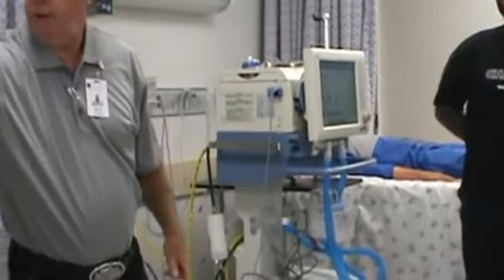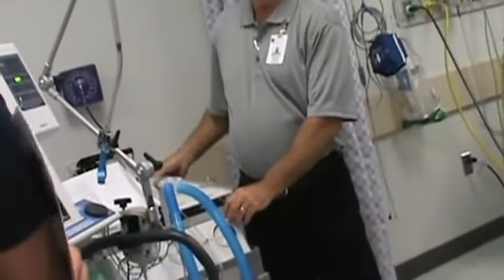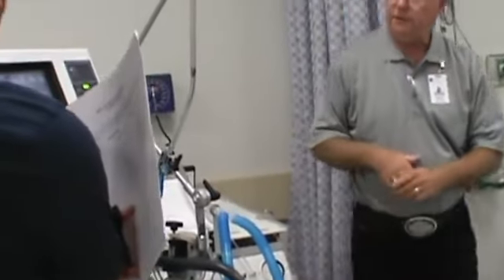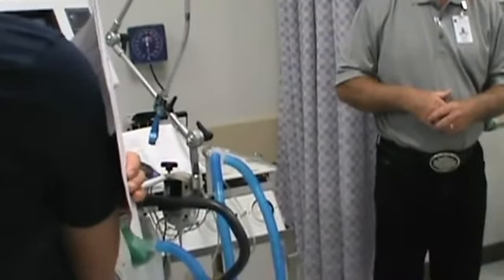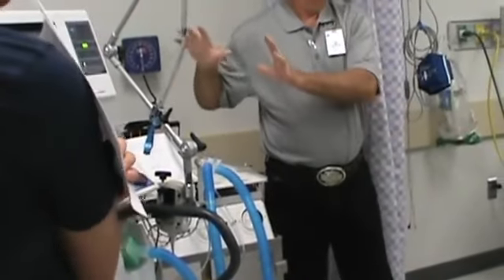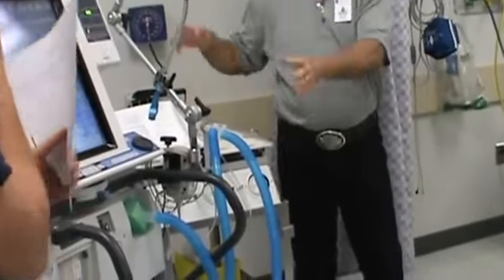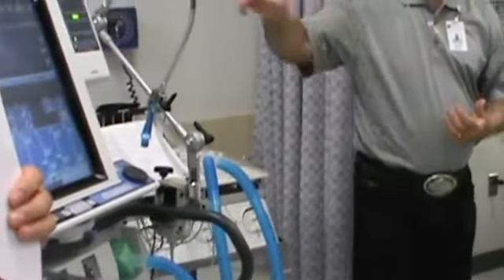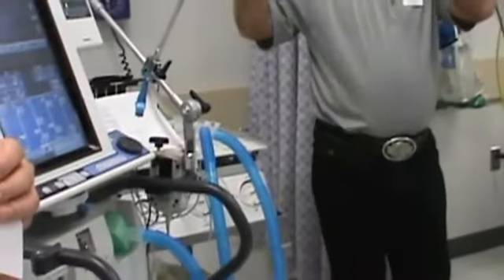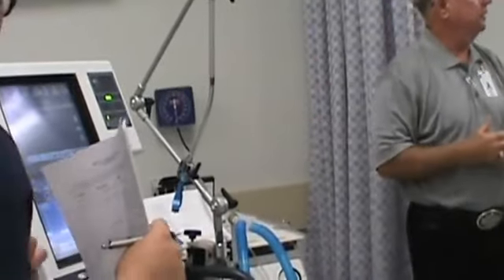Now, everybody knows about these letters up here. Now, see, there's an A. There's a C. The C is control. The machine's doing everything. An A is the patient took the breath, but the machine delivered the volume. If you see an S, the patient's doing everything. So, how do I know when it's a good breath? Look for the one that you can get a C on.